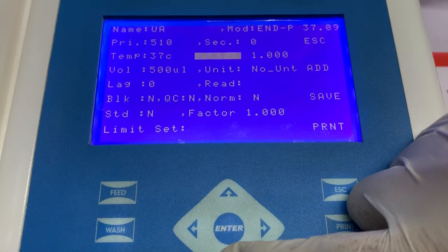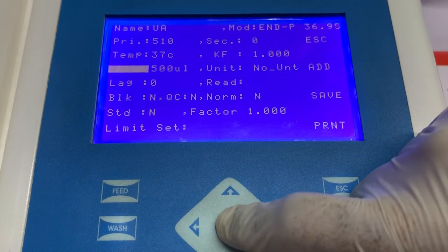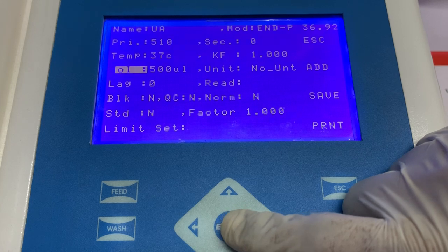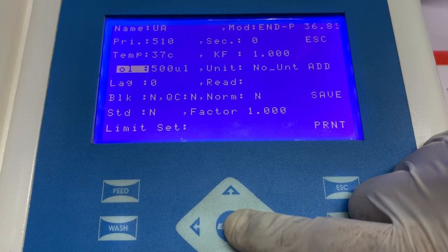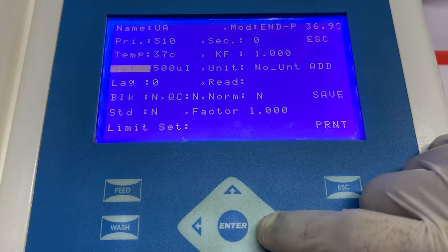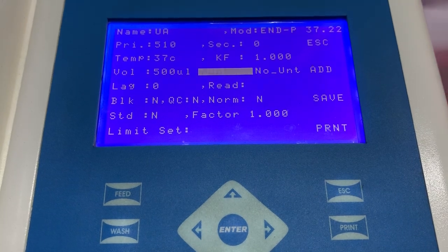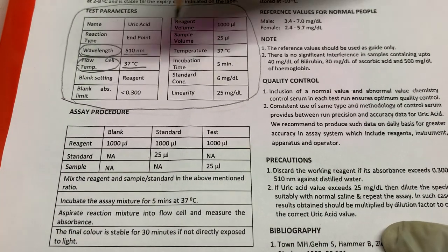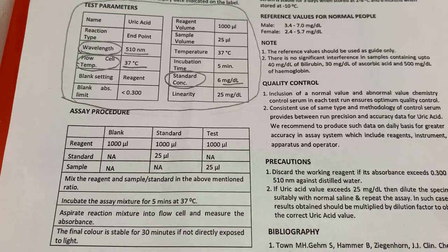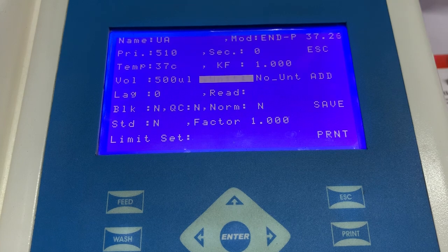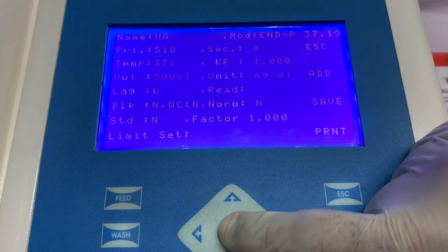Next, we have to enter the information of KF, or kinetic factor, which is to be maintained at 1.0. Next, we have to enter the information of aspiration volume. Aspiration volume can be maintained at 500 microliters, but if you are doing the entire test in 500 microliters, then aspiration volume can be reduced up to 400 microliters. Next, we have to enter the information of units. To check what units to enter, see the instructions for use and check the units mentioned in the standard concentration. Whatever units are mentioned in the standard concentration, the same unit must be entered into the software. Select the option of units and from the list select the unit mentioned in the instructions for use.